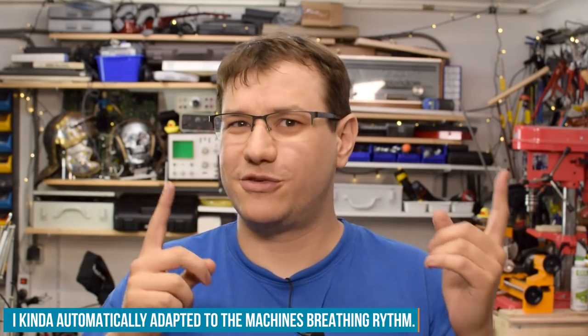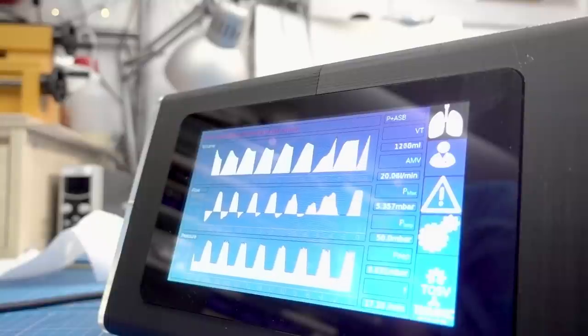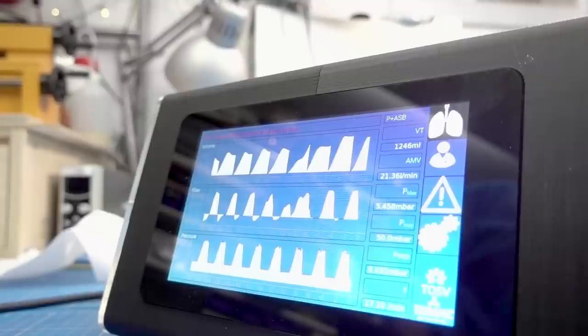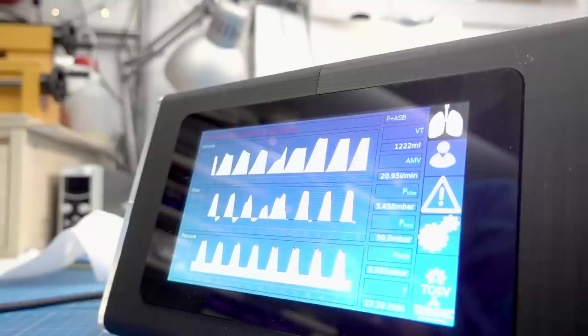And that's really interesting. It also has an effect that I encountered after a few minutes: I change my rhythm according to the device, and my own force gets slower over time so I can get more assistance. So you see that it's a very intelligent device that dynamically adapts to the person that is breathing with it. And that is what a proper ventilation apparatus does.